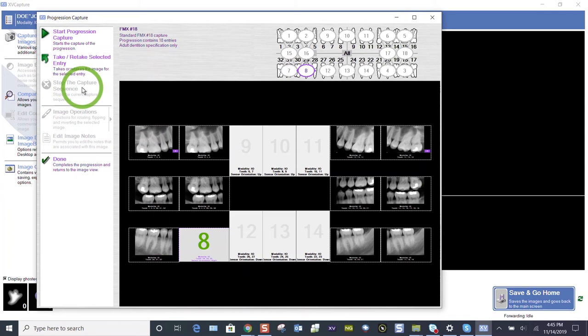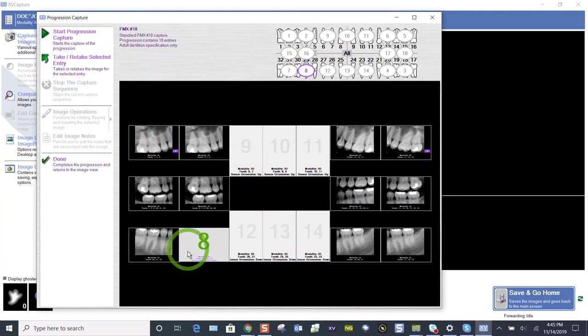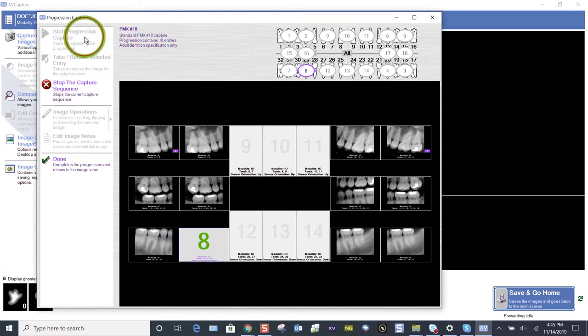But at any point, if it gets into that unready mode, you can ready it again. Pick up where you left off on that tile and start your progression again.